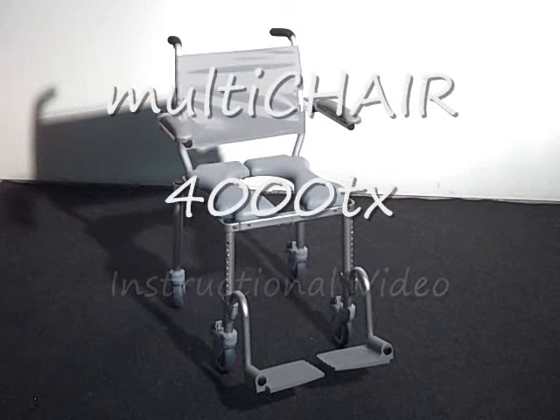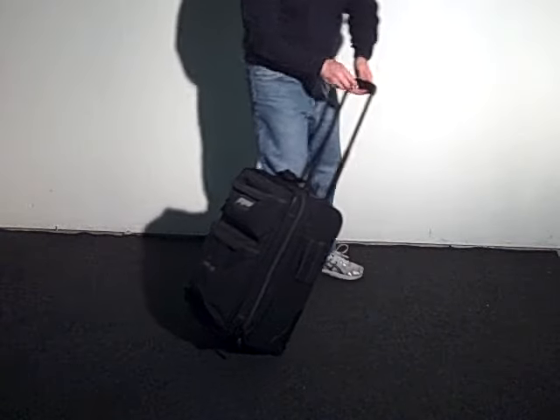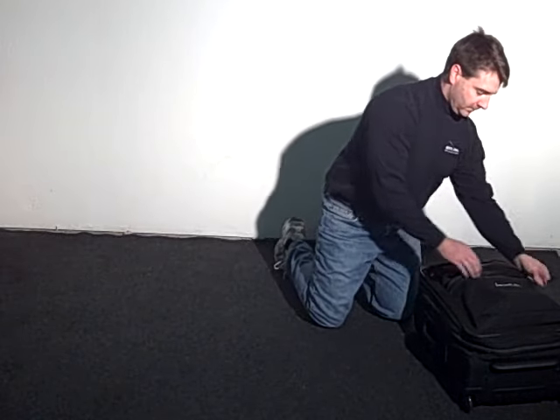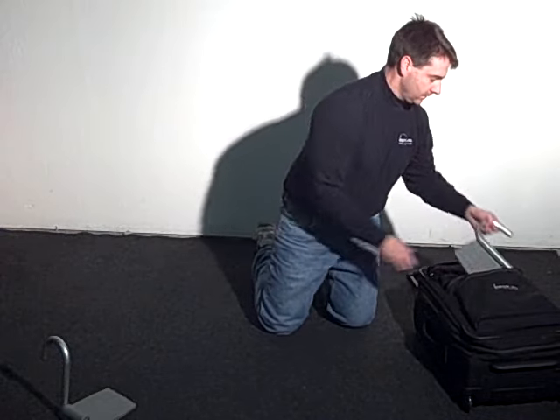The following is an instructional video which explains how to assemble the MultiChair 4000TX. The first step is to unpack all the parts from the included carrying case.